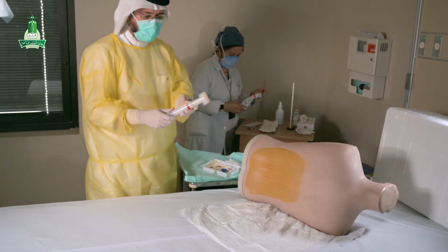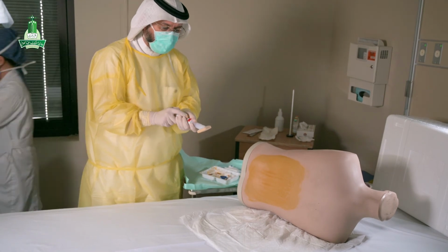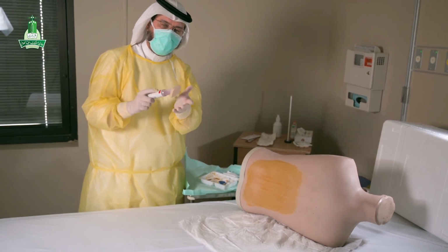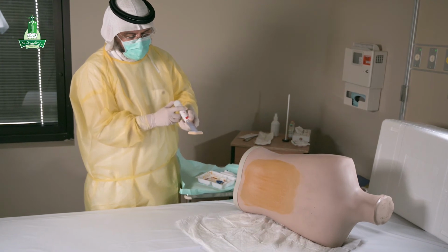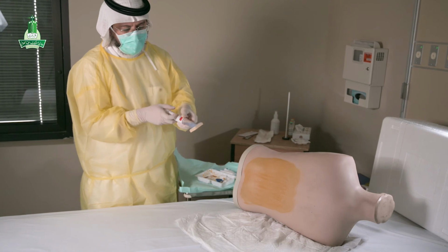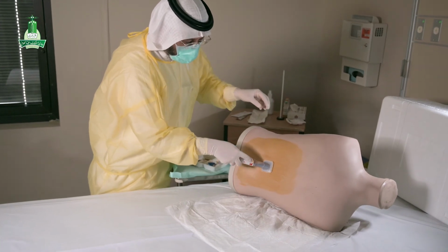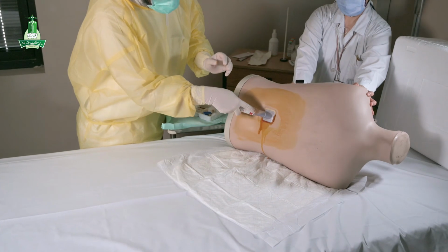okay, so this is chlorhexidine. You break it, you press to let the disinfecting solution go to the applicator itself. Okay, and then go to the center, press hard. You see, now the solution is pouring.